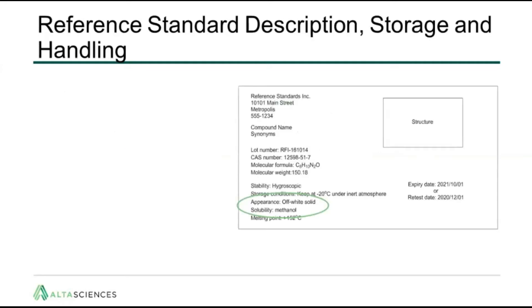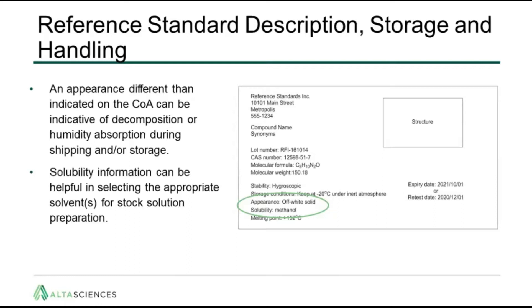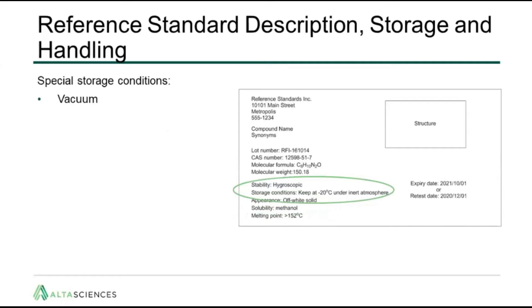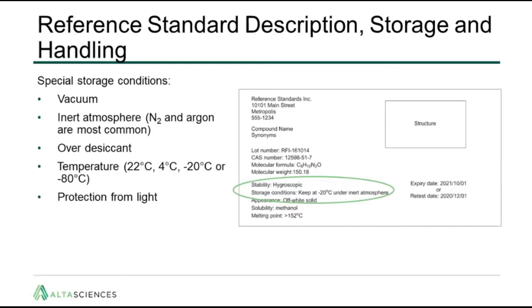Now let's look at reference standard description, storage, and handling information on the certificate of analysis. An appearance different than indicated on the COA can be indicative of possible decomposition or humidity absorption during shipping or storage, so it's important to compare the COA information with what you actually receive in your vial. Solubility information can be helpful in selecting appropriate solvents for stock solution preparation. There may be special storage conditions required such as vacuum or inert atmosphere — nitrogen and argon are most common. The compound may need to be stored over desiccant if it is hygroscopic. Different temperature requirements and protection from light may also be required during storage and/or handling.